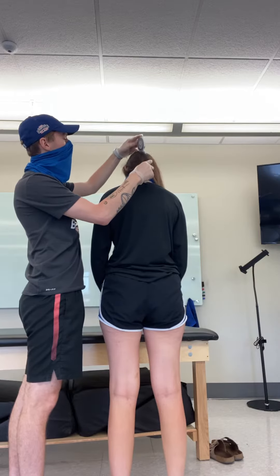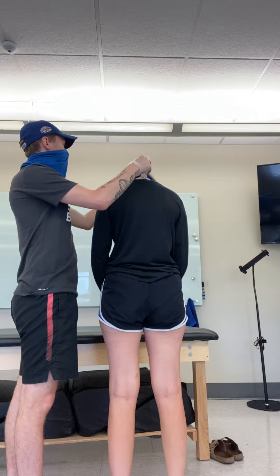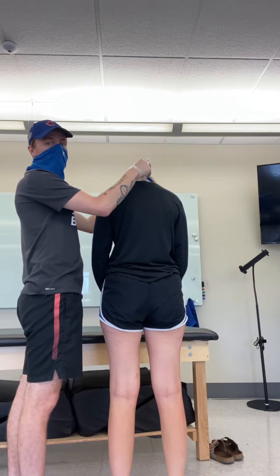And then Hannah, will you flex for me? She's at 55 up top and 20 down below, so that means she has a flexion of 35 degrees.